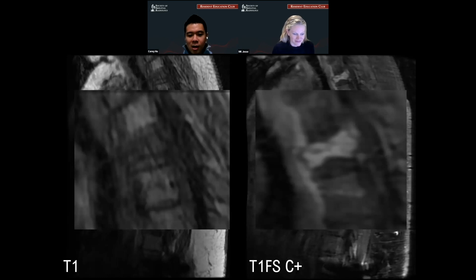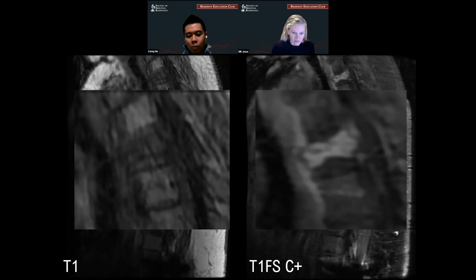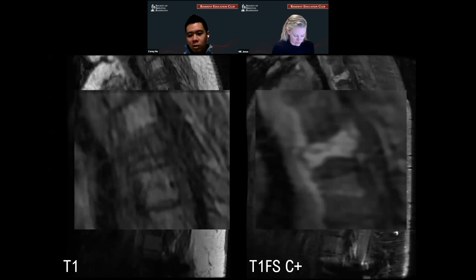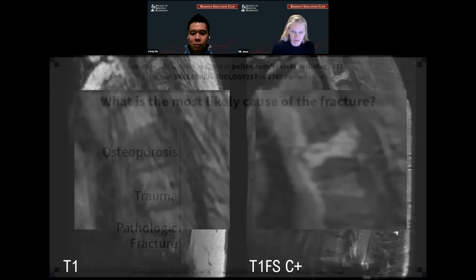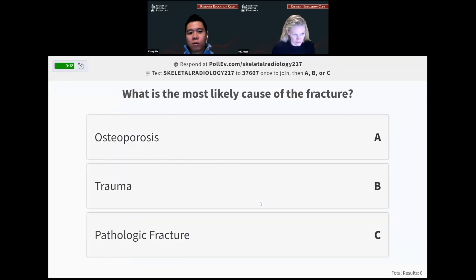It's the T1 vertebral body that I'm highlighting here. On the left image, on the T1 sagittal image, we show hypo-intense signal throughout that T1 vertebral body, and on the post-contrast fat-saturated sagittal image on the right, this shows diffuse enhancement. You also know that the shape of the vertebral body is abnormal — it's a little bit squashed as compared to what you'd normally expect.